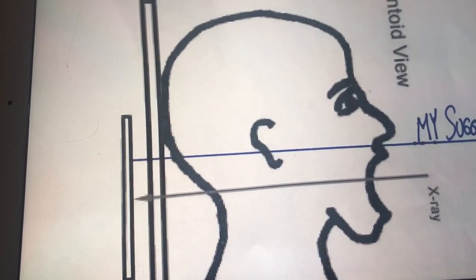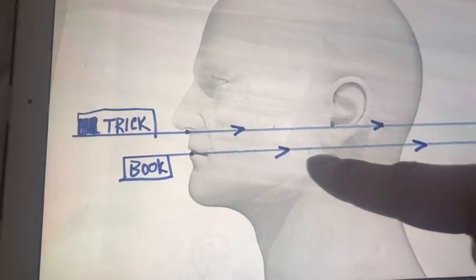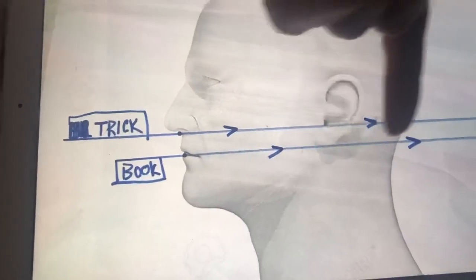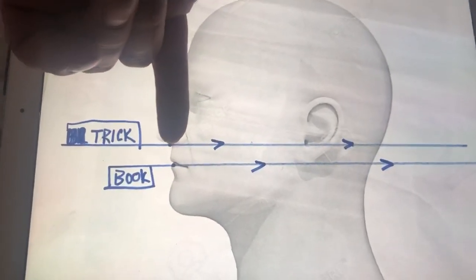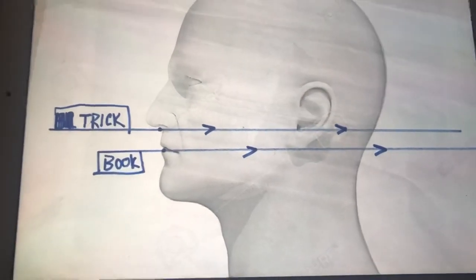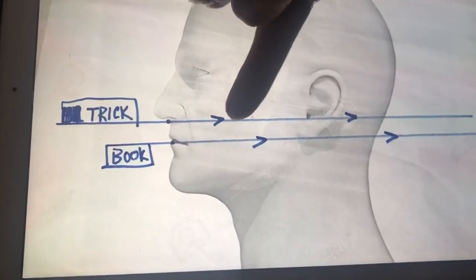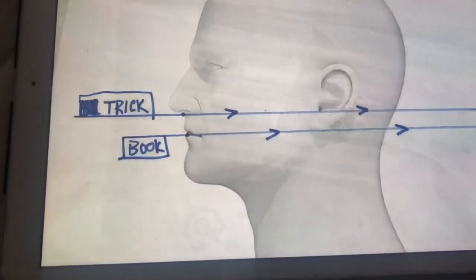I can show you what it looks like in a radiograph. This is the book view here — this is what they tell you in the book, to go right down this bottom line. And this is what I'm showing you: bottom of the nose, top of the lip, going all the way through bisecting the EAM and out again. If you do that and then bring it down to where the patient opens their mouth and there's a crease, you'll nail it.